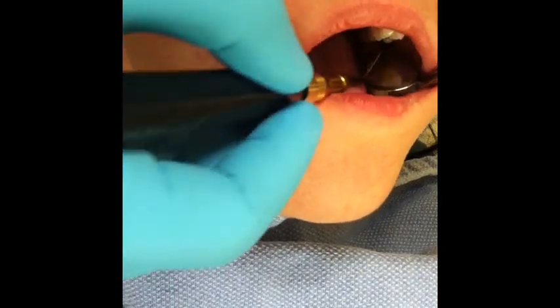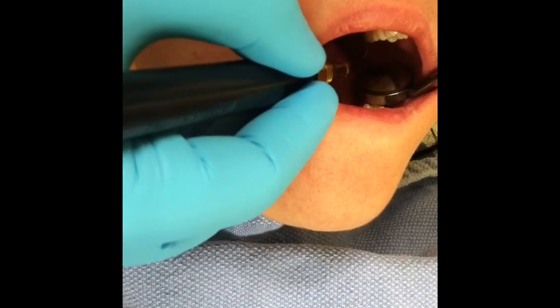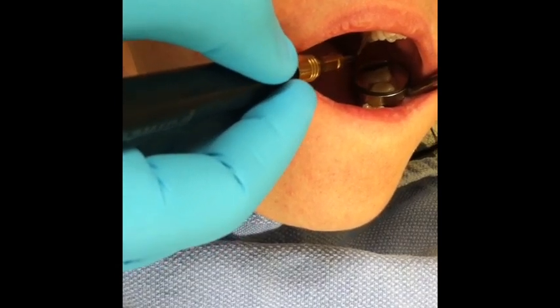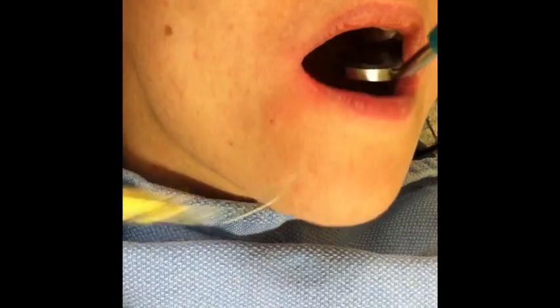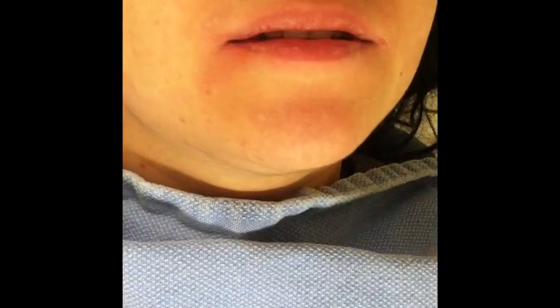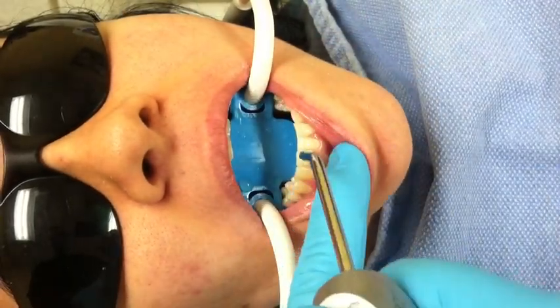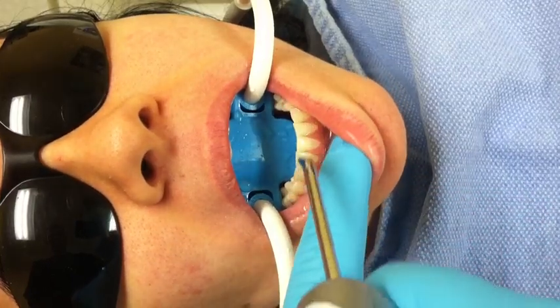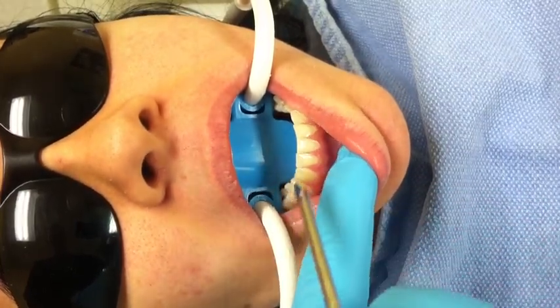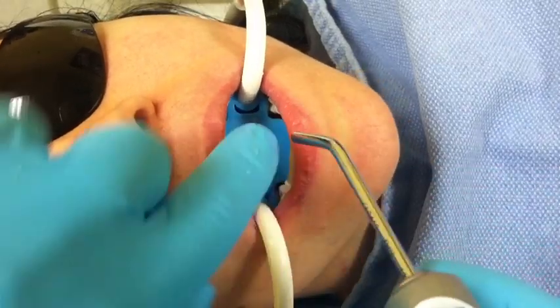Every now and then you just have the patient close down on the suction mirror. Right here I'm getting the distal of the last molar - two suction mirrors are probably the best thing you can use for that; you can actually see what you're doing. In this short clip, I'm just showing how well the Kona block suctions - you can literally rinse the teeth and the patient's not really feeling anything going down in the throat.